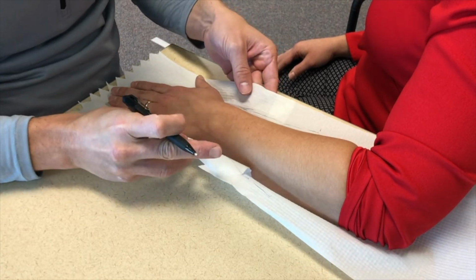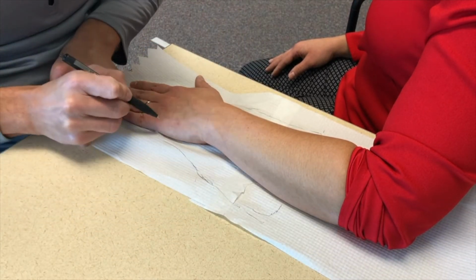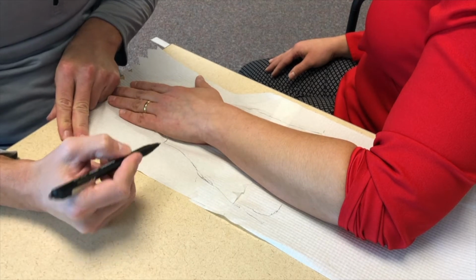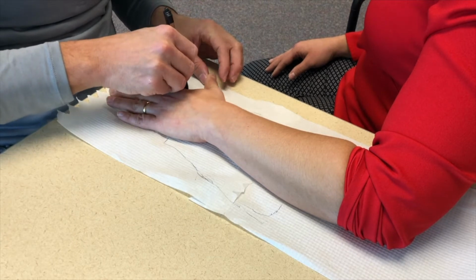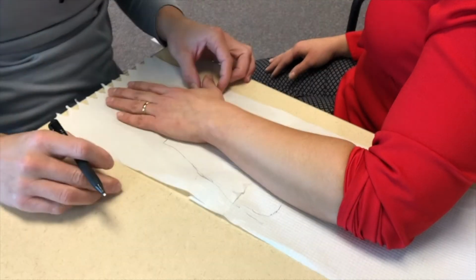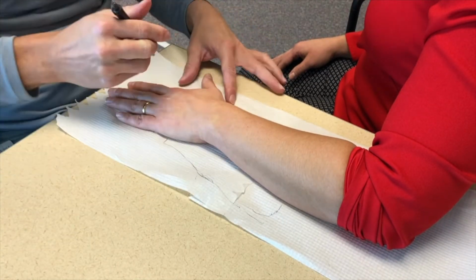When you're drawing your pattern, you need to identify certain areas. First, we want to identify the metacarpal head, which volarly is going to be your distal palmar crease. We know that here is our metacarpal head for the index finger. We need to identify that landmark. You need to identify the web space between the thumb and the index finger, and then the base of the first CMC joint.